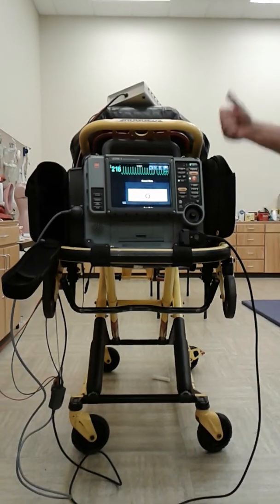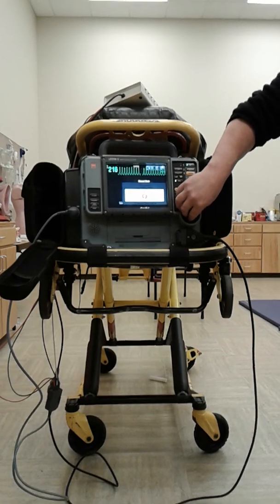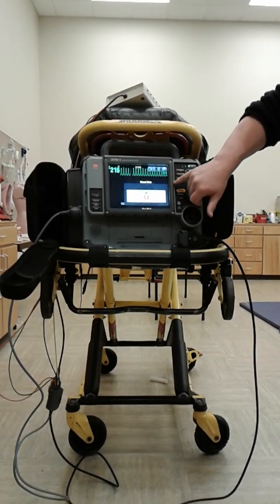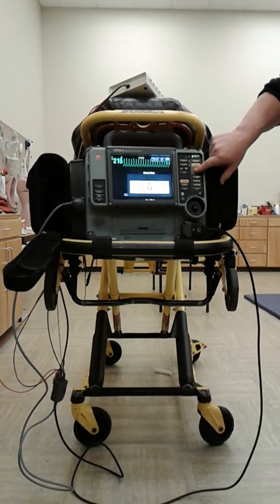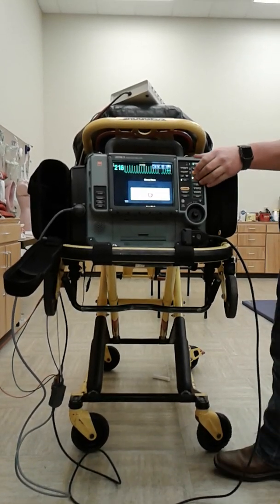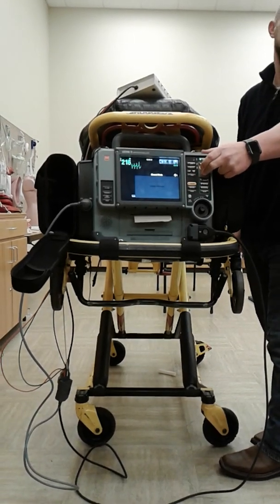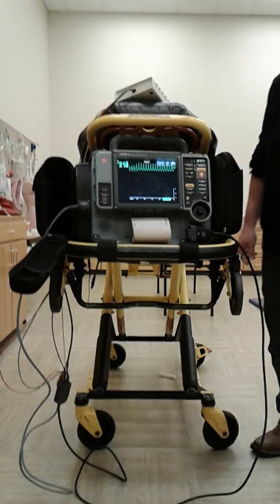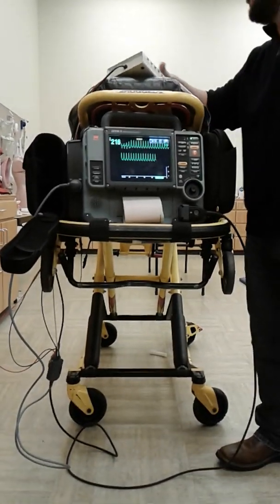Okay? One patient described it to me as being kicked in the chest by a mule. Okay? So, that's letting you know this is hot and ready. When you hit that button right there, you're fixing to deliver electricity. Okay? So you're going to hit and hold. You're going to hold it until your patient goes, or they come off the stretcher, clap their hands, do whatever they got to do, and deliver. Notice how it started printing out. Okay, now I'll show you what it would look like if you converted it.